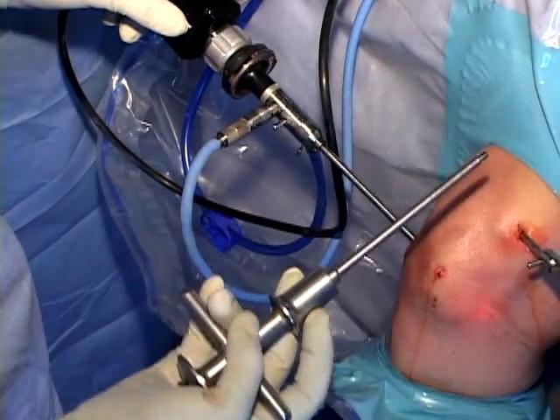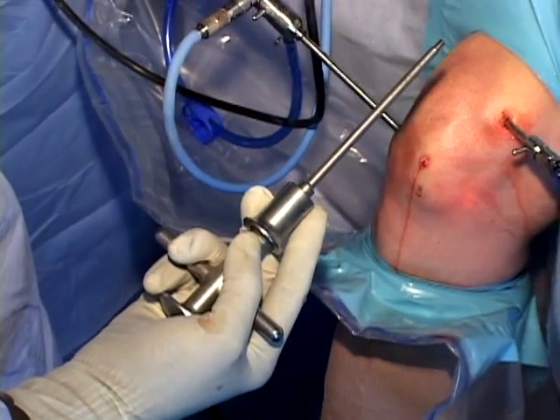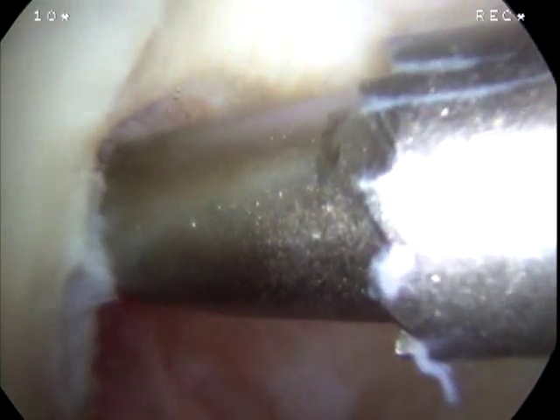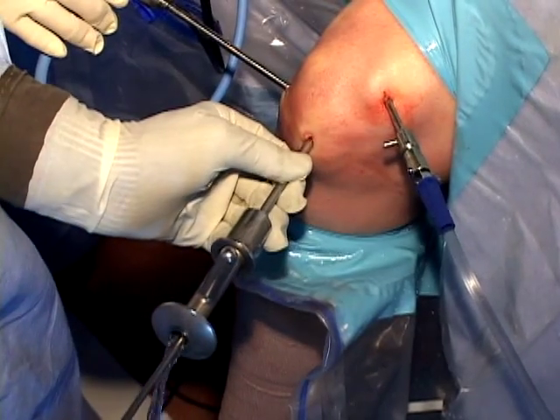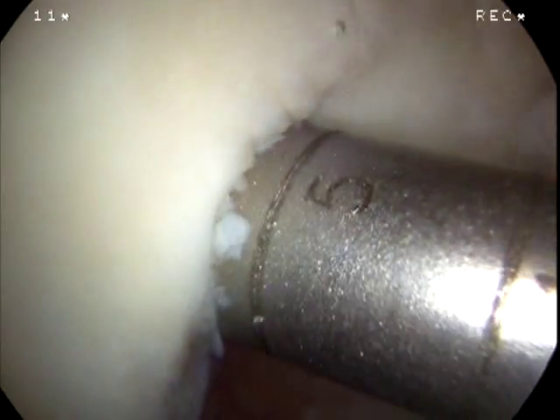To harvest the bone and cartilage required for paste grafting, a trephine is brought through the anteromedial portal into the intercondylar notch. The 8 mm trephine is then used to harvest a 15 mm deep core of articular cartilage and underlying bone.